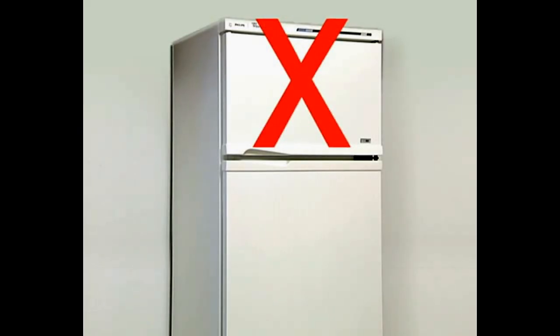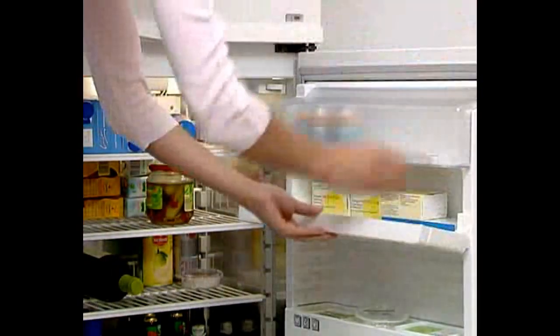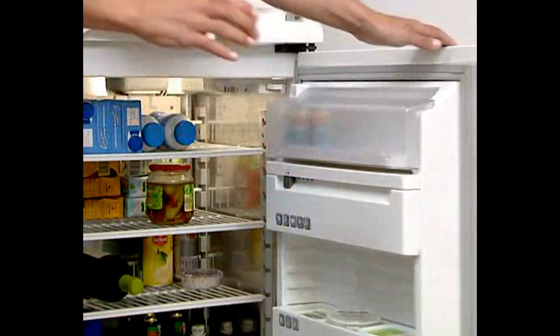Purigone, however, should preferably be injected at room temperature, so remember to take the cartridge out of the refrigerator a few minutes before you are ready to give yourself an injection.